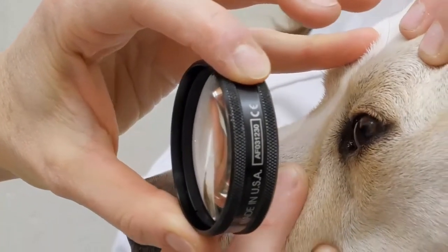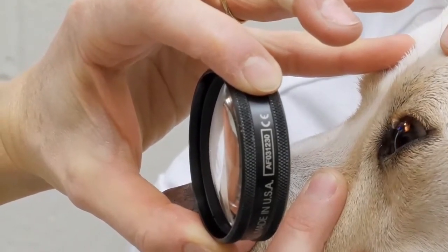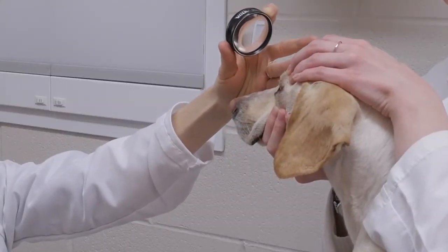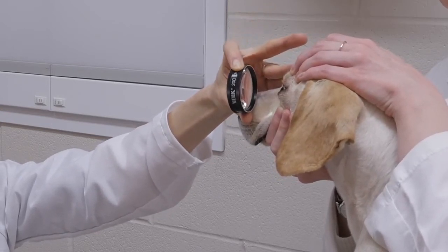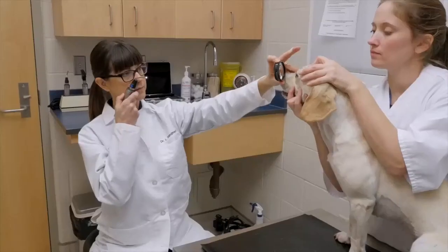Once an image is obtained, the lens can slowly be pulled away from the animal so that the image is maximized and fills the lens. If the image of the retina is lost, the lens is pulled away from the front of the cornea, but should still remain stabilized to the animal's forehead, and the examiner should reobtain the tapetal reflection and then replace the lens in front of the cornea.